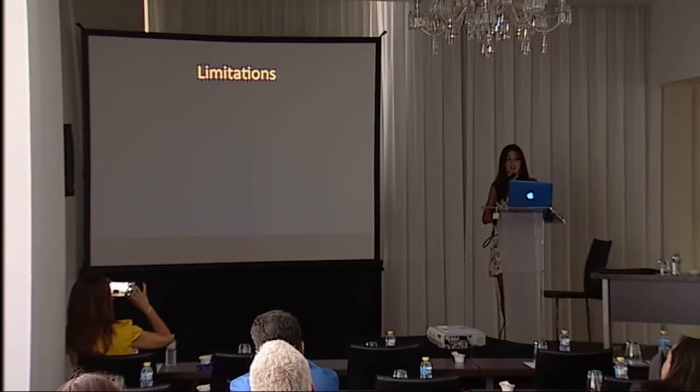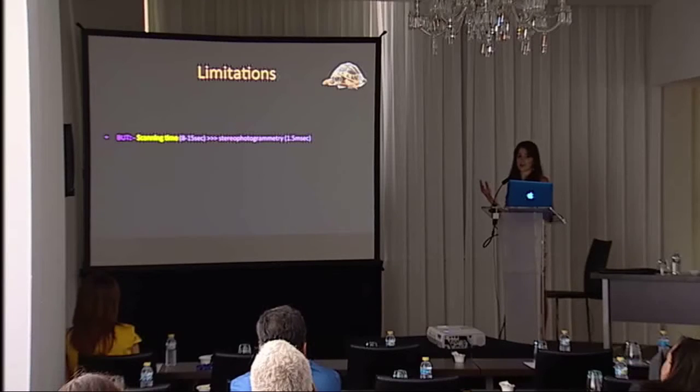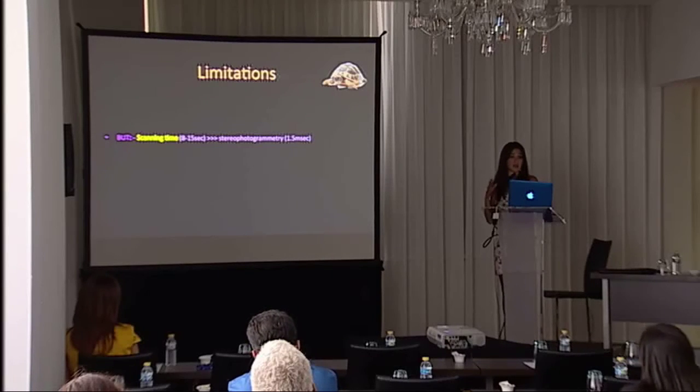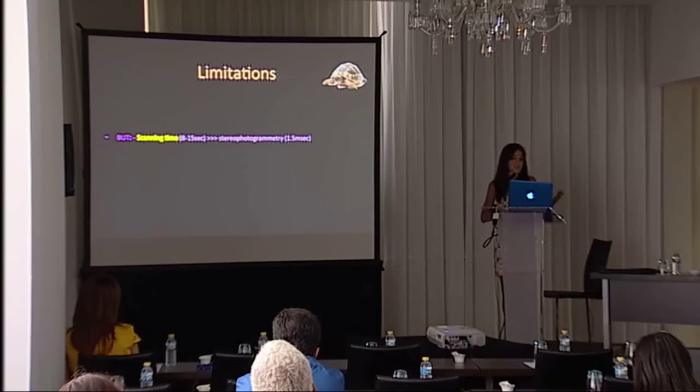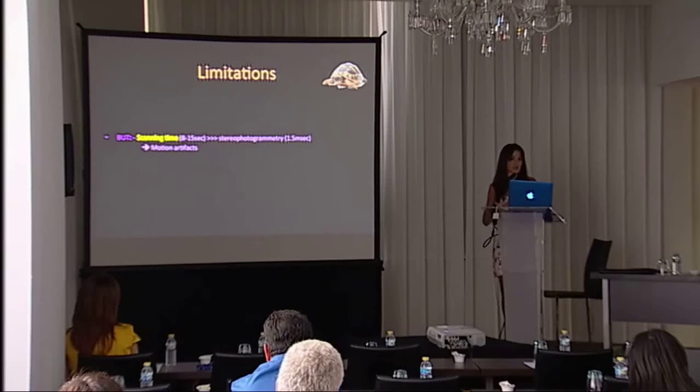However, it still has some limitations that are worth mentioning, like for instance the long scanning time, especially when compared to the stereophotogrammetry, which is also a non-invasive and non-ionizing imaging technique, but that's not based on laser. So this long scanning time will induce motion artifacts, which makes this technique less advantageous to use for children or agitated patients, for instance.